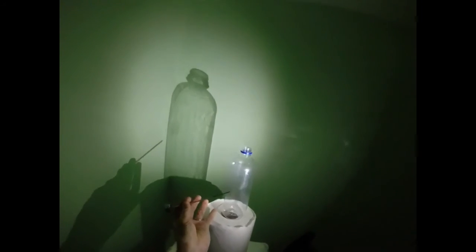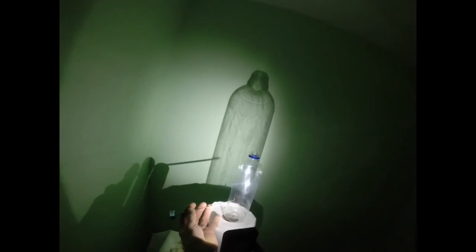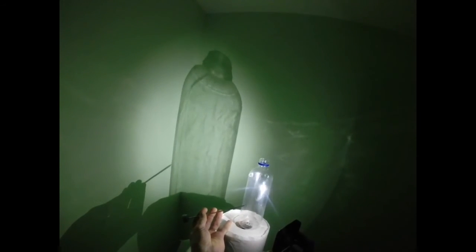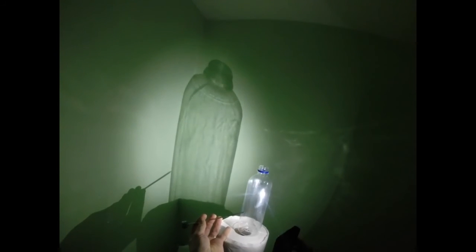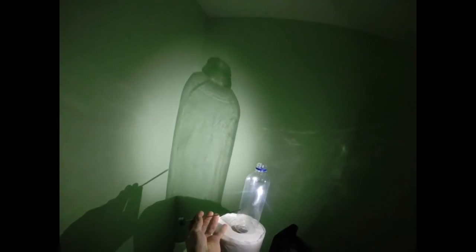With situation number two, when my needle tip is away from the midline in lateral view, I can see my needle deep inside the shadow. With the contralateral oblique view, on the other hand, I can see my needle tip touching the edge of the shadow.